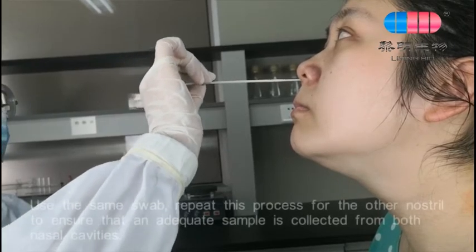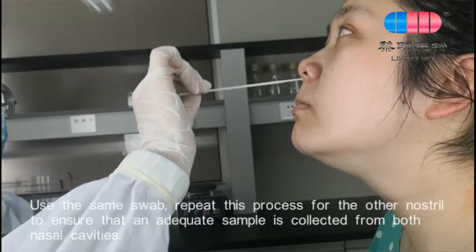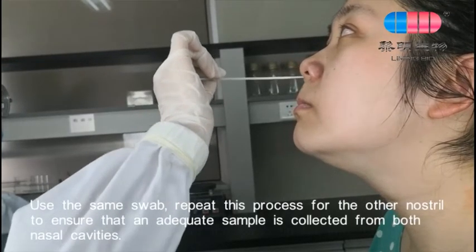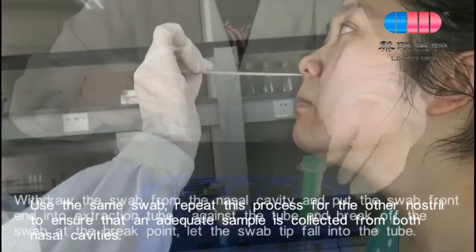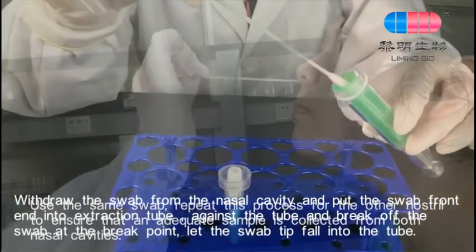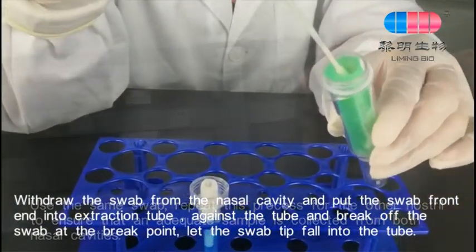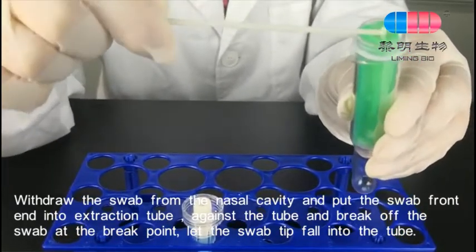Use the same swab and repeat this process for the other nostril to ensure that an adequate sample is collected from both nasal cavities. Withdraw the swab from the nasal cavity, pull the swab front end into the extraction tube against the tube, and break off the swab at the break point. Let the swab tip fall into the tube.